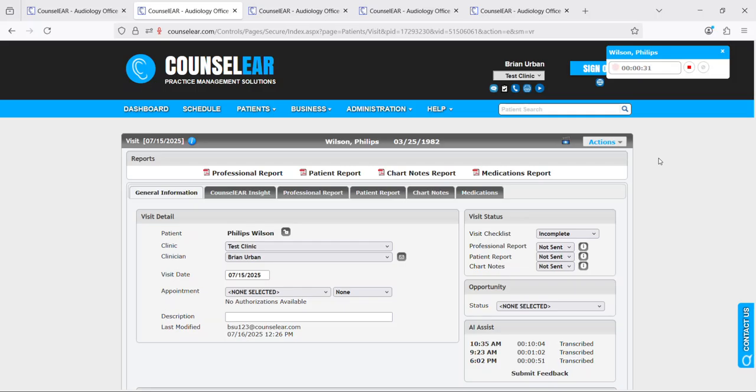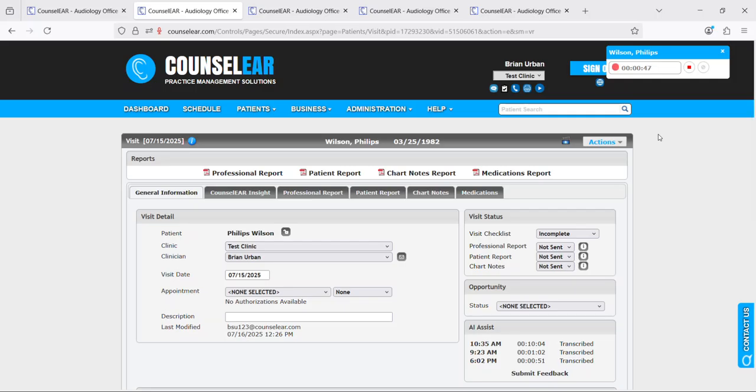But most commonly you would start this at the start of the patient encounter, whether it be a diagnostic evaluation, whether it be a simple clean and check, whatever the scenario. It's collecting information along the way here and then once we're finished you click stop and it will create that transcript.